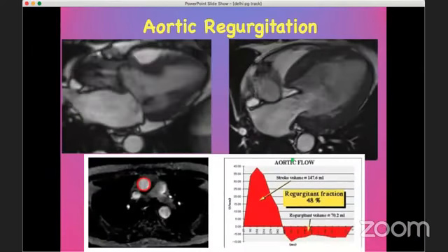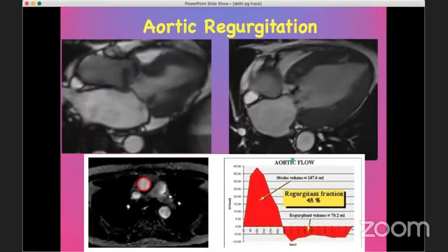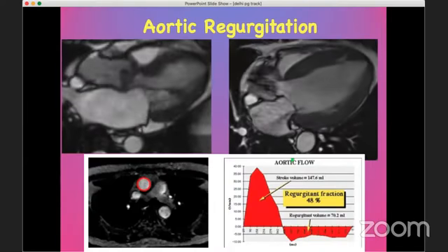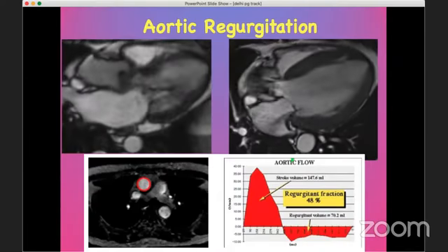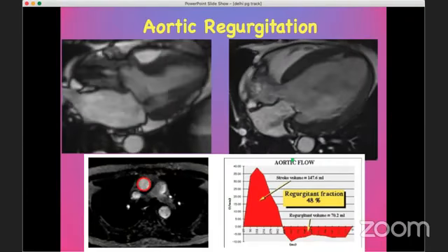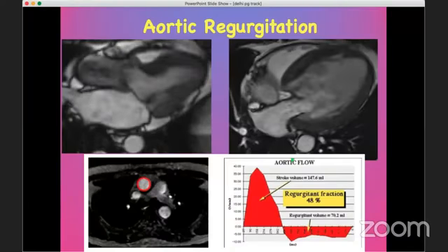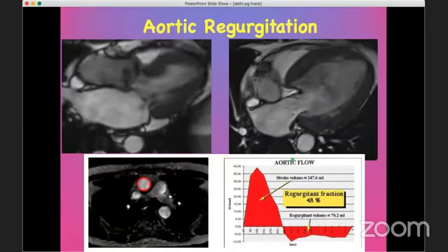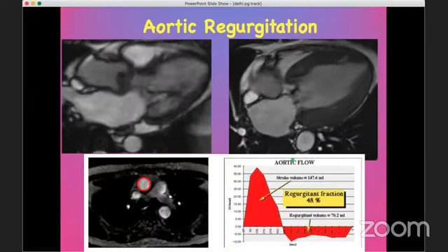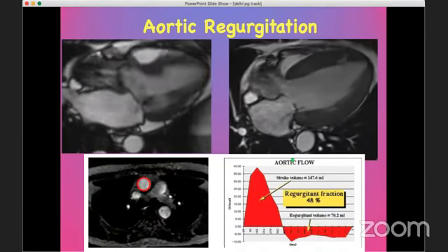What is also important in the era of TAVR is that a patient who has renal failure and you're not able to do a CT for any reason, we can get similar information from the MR without having to use gadolinium by doing something called TOF images, where we can actually assess the valve as I've shown you, and also look at the aortic root and the proximal and descending thoracic aorta on MRI, and serves as a very good secondary supplement to CT wherever it is not possible.